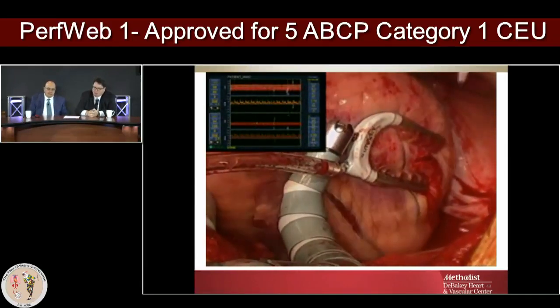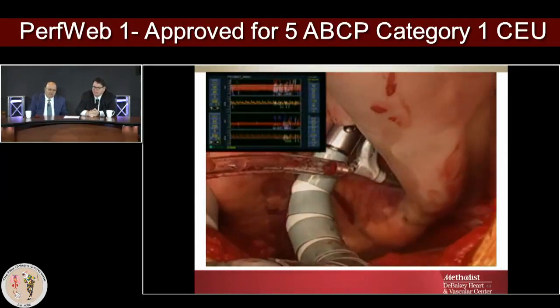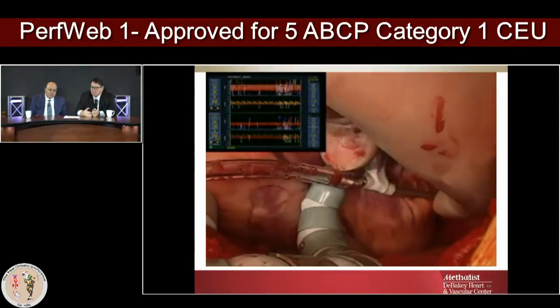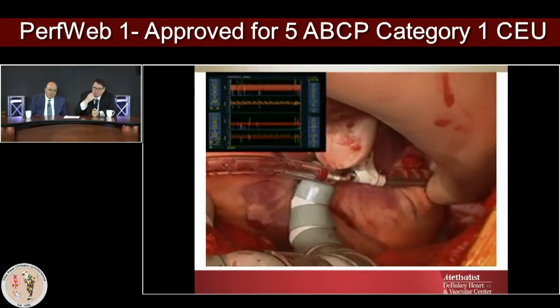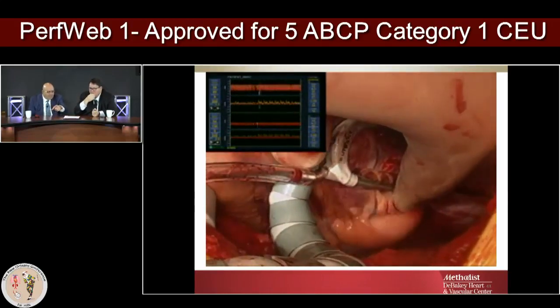So this is an off-pump case, and see the CO2 blower came in and suddenly blew the air into the brain. So for us, this is still stunning, hard to explain how. But they didn't know this was happening, right? They didn't know this was happening at the time.